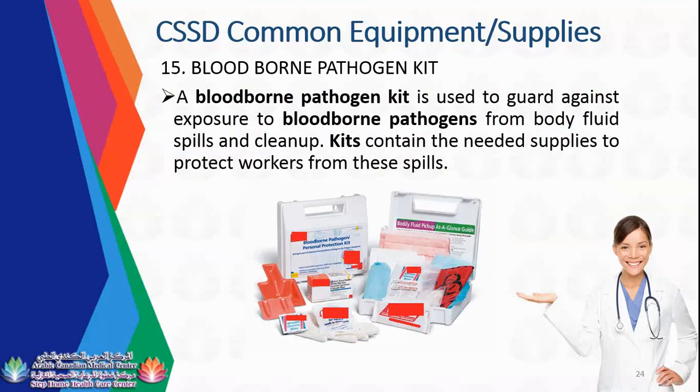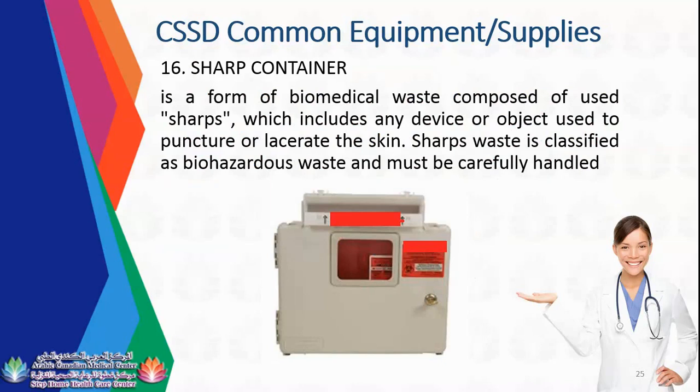Sharps container is a form of biomedical waste composed of used sharps, which includes any device or object used to puncture or lacerate the skin. Sharps waste is classified as biohazard waste and must be carefully handled. You can see the same sharps container in our CSSD room, but it is not commonly used.